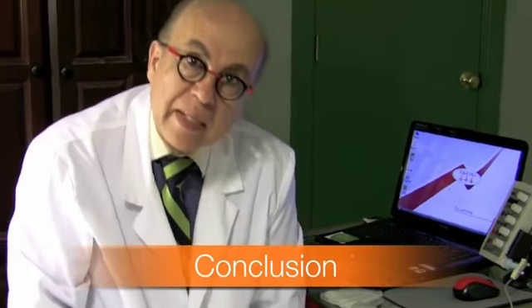So now we're done with the needle exam, and we looked at the upper and lower extremities and the paraspinals, and we use muscles that will show changes with the most commonly encountered conditions that come to the EMG lab. What I want to remind you of is that in the muscle we do 2 stages of investigation. The first one is the insertional activity, in which we're looking for fibrillation and positive waves, and whether or not there are spontaneous activities like fasciculations, myotonic discharges or complex repetitive discharges, etc.